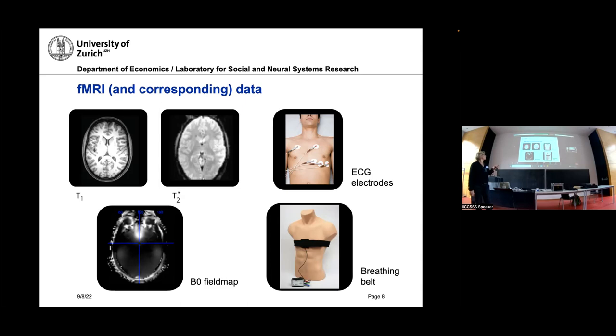This is what we want in general, but to be able to interpret these data, we also need structural data, because otherwise we don't have any idea where we are in the brain. Might be everything.